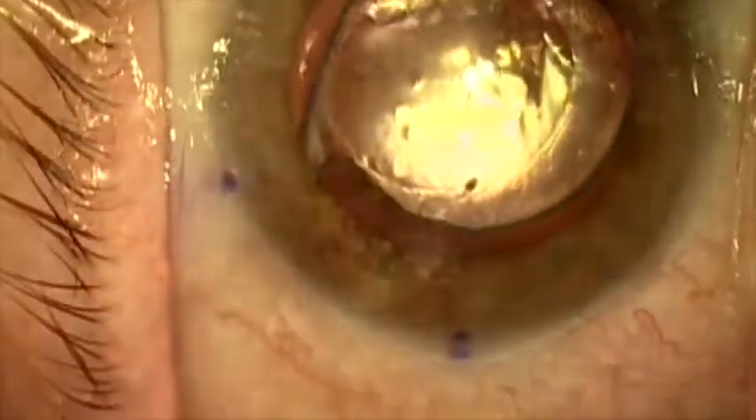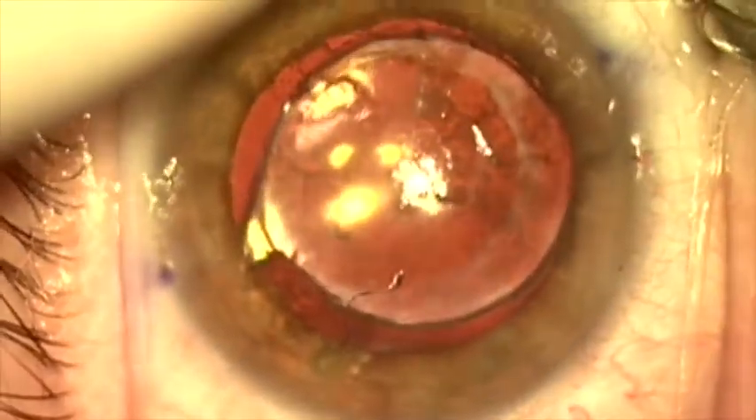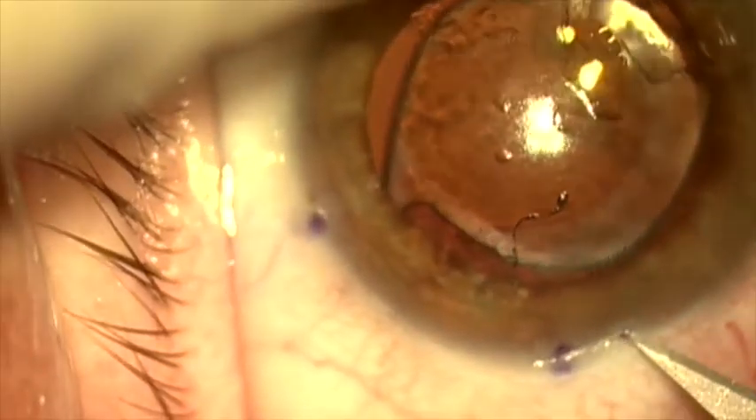We're using the lens's current axis to mark the new axis, which will be about 25 degrees away. I'm making my incisions here to get the case started.